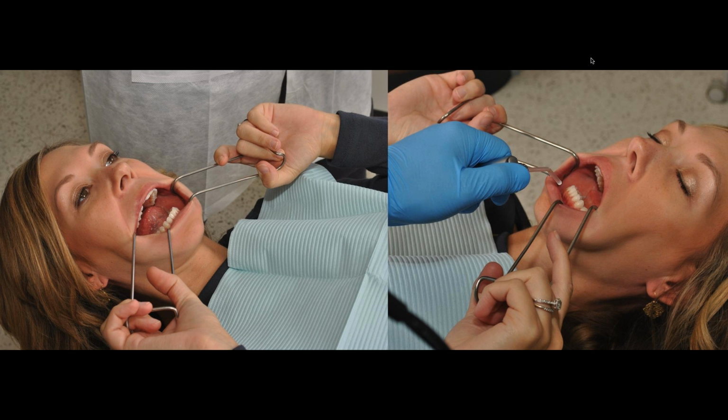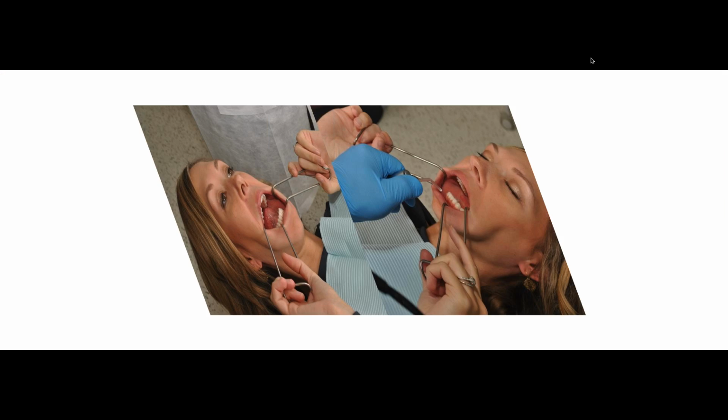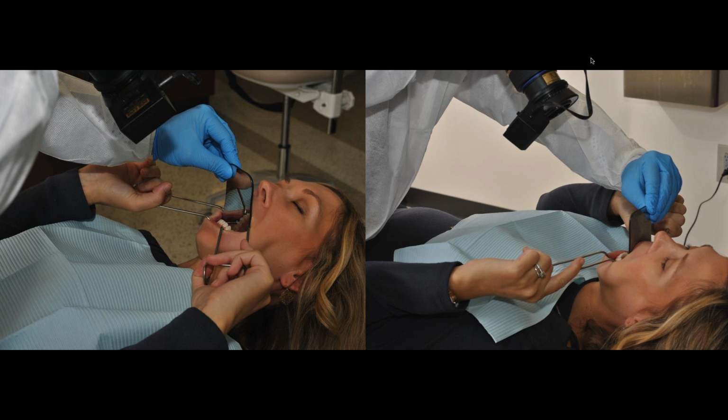Okay, now we're going to do the mandibular shot. For this photo, you always need to have your patient leaned all the way back on the dental chair. So you lean the patient all the way back. Now we have her retract the lower lip. We dry the facial aspect and the occlusal surfaces of the teeth. We have the patient place the tongue against the palate. You can see that on the left photo. And now we're going to push the tongue with the mirror towards the distal, towards the back of the patient's mouth. We have her open wide, and look at the camera.